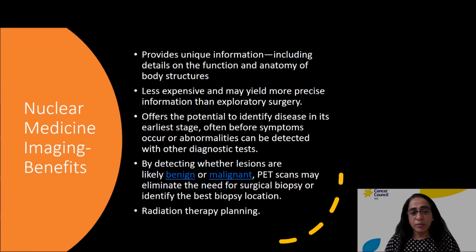Benefits of nuclear medicine studies are they provide unique information, detail of the function and anatomy of body structures. They are less expensive than exploratory surgeries. They have potential to pick up disease early. They help distinguish benign from malignant lesions, and can help eliminate the need for surgical biopsies. Or they can identify the best place to biopsy lesions if there are multiple metastatic lesions or suspected metastatic deposits. They help in radiation therapy planning.